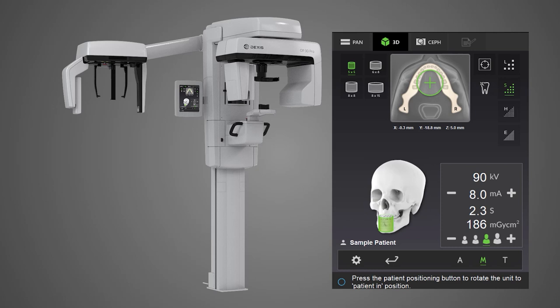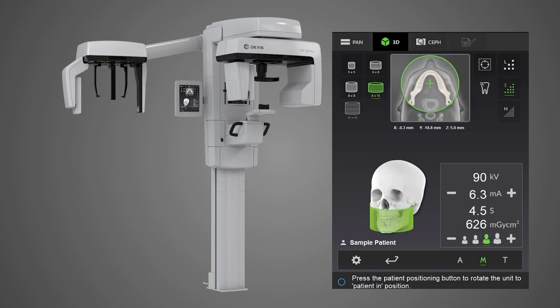When using a small panel, choose 5x5 or 6x8. The medium panel includes 8x8, 8x15, and the optional 13x15. Select the area of interest to be scanned.